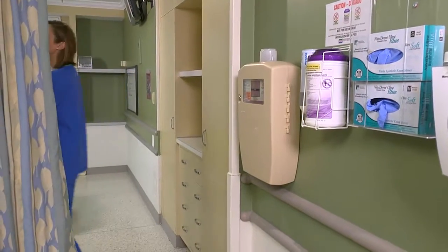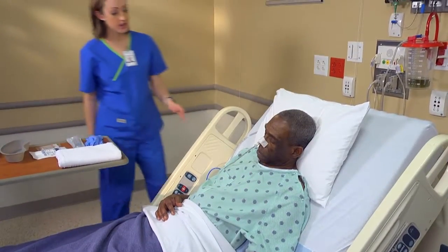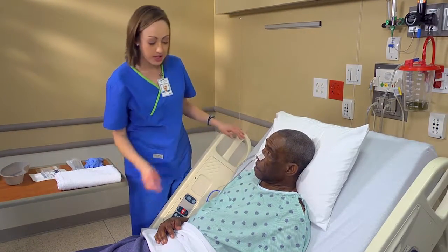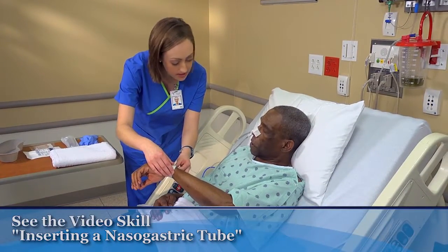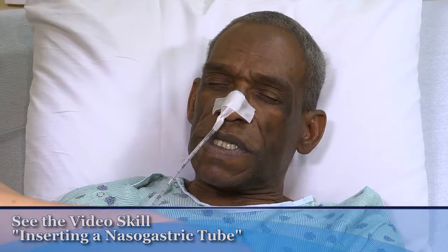Ensure privacy and introduce yourself to the patient. Hello, my name's Laura. I'm your nurse today. Then identify him using 2 identifiers. If the patient has a nasogastric tube or NG tube, verify its placement before taking a sample.